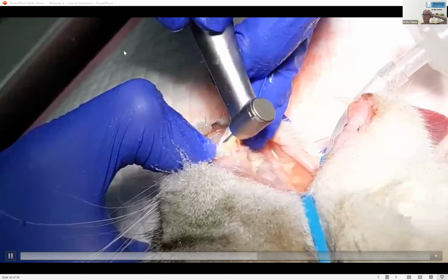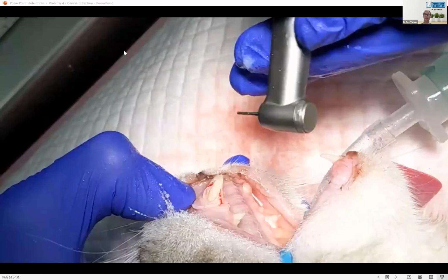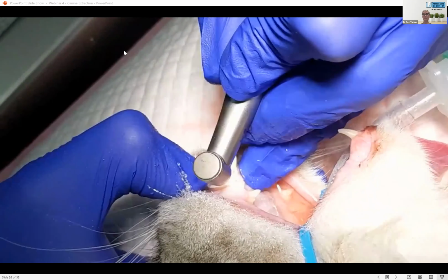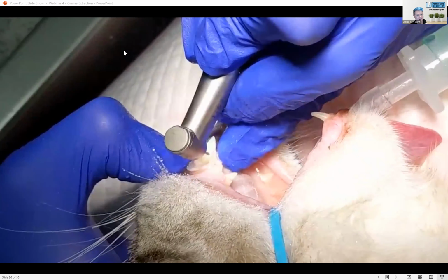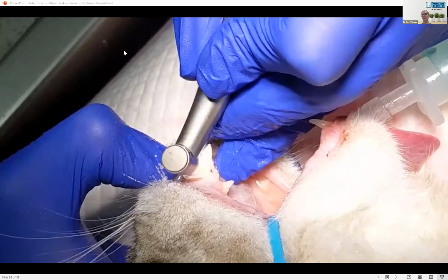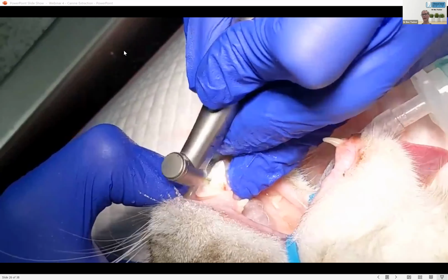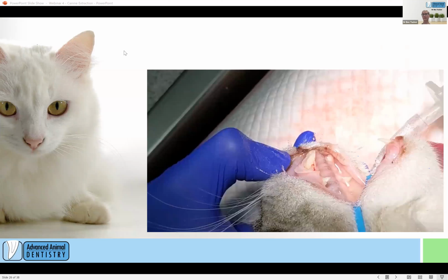The ET tube, we use a rubber band. We go to Officeworks and get quite a large rubber band, so it's not too tight around their head. And we simply loop it around the ET tube. I really like it because these are my spare ones at home. They leave a really small imprint in the mouth, and if you use a fabric type of tie or the likes of that, I find you're more likely to catch that in your burr. These also grip the ET tube really well, so the tube isn't sliding around. It really fixes it in position well.